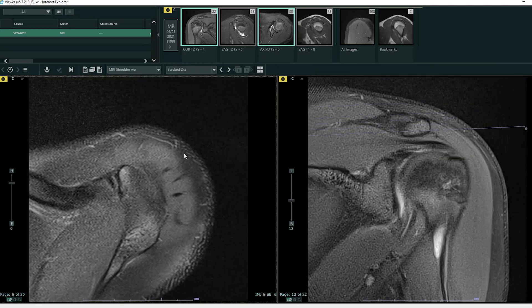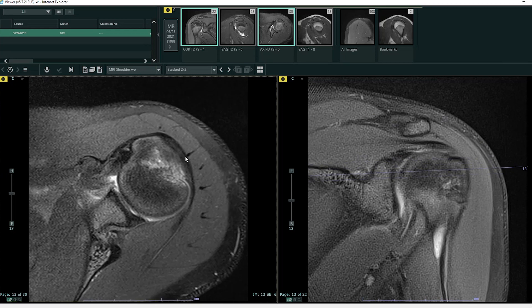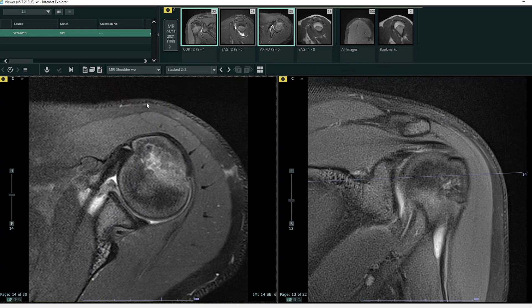Moving to an axial series — now we're cutting the patient from superior to inferior. Here is anterior, the patient's front; here's posterior, the patient's back; here's lateral or the outside; and here's medial, towards the patient's chest.